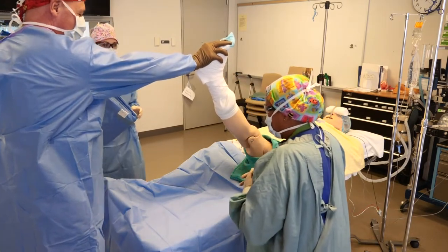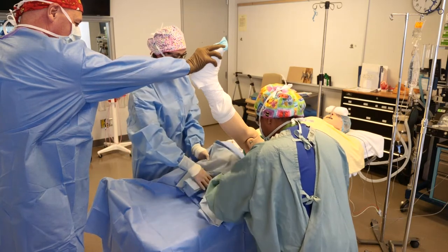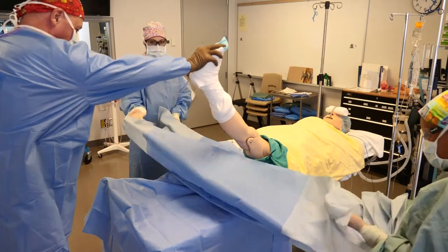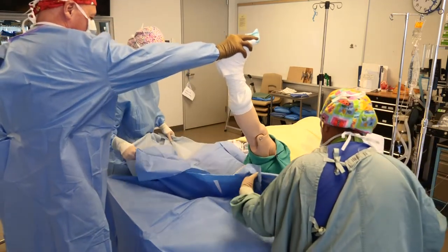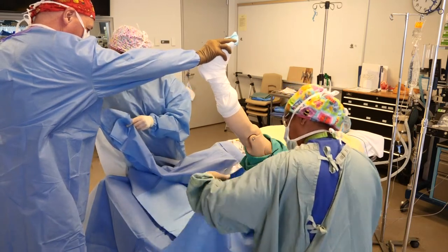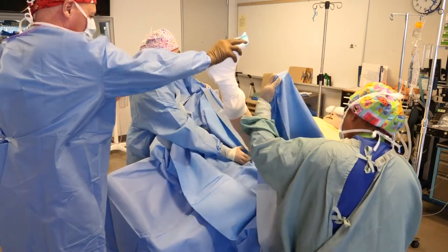Now we have a second assistant who will hold onto the leg as the resident then applies the split sheet. A split sheet is a drape that has a split right down the middle. The first fold is often unfolded to cover the bottom of the OR bed. For the second fold, the adhesive tape is removed, and once it's removed, the adhesive will then be applied just on top of the towel.